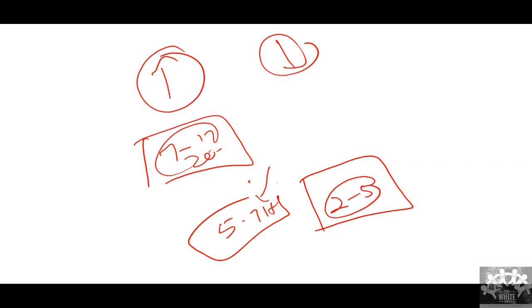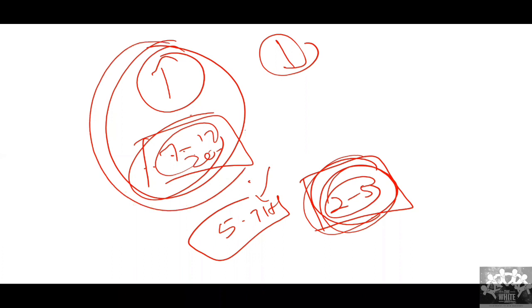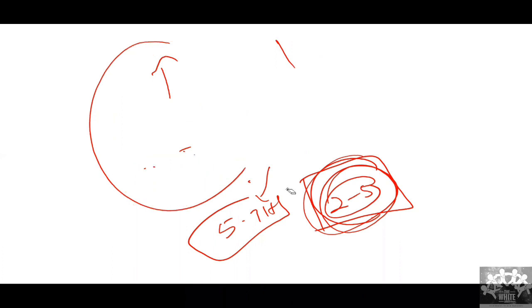Like, you don't have to use particular probes. Even in the abdomen, if you want to see the wall of the abdomen, again, I prefer the high frequency probe. If I want to go slightly deeper into the wall, I'll still prefer the high frequency. But if I want to see the deeper structures, I cannot see them, so I'll have to go for the curvilinear probe. Imagine a very lean patient. Again, I can use only the high frequency probe and do the scan. That's how I can do the scan.